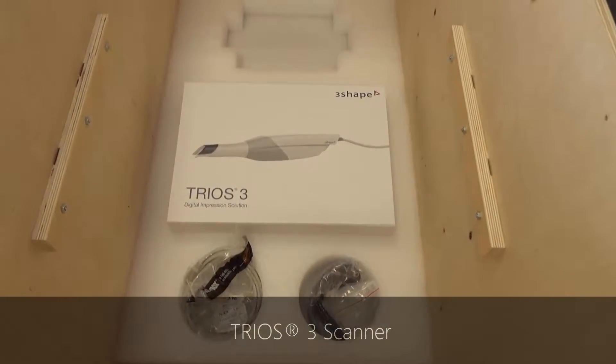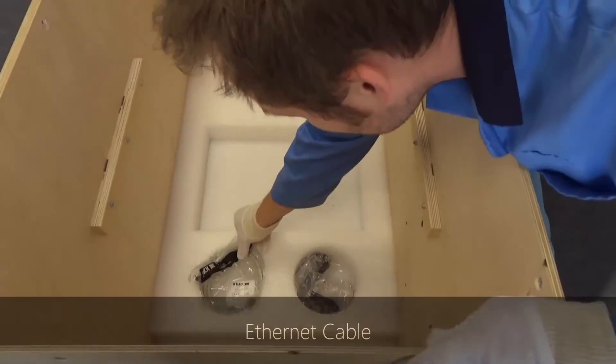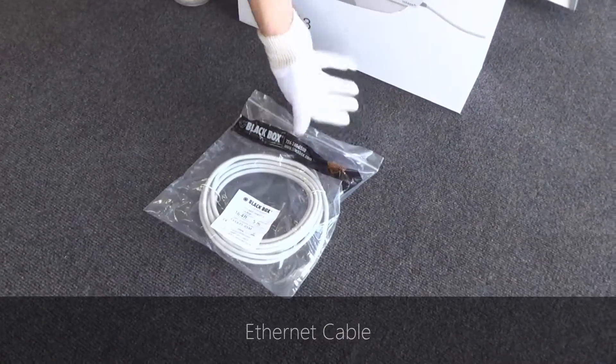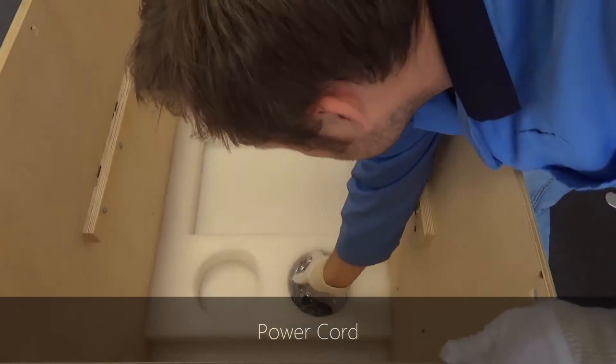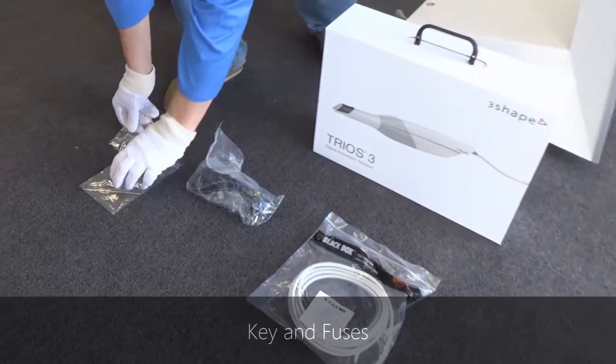You now have access to the box with the Trios 3 scanner, the Ethernet cable, the power cord, and the Allen key and fuses.